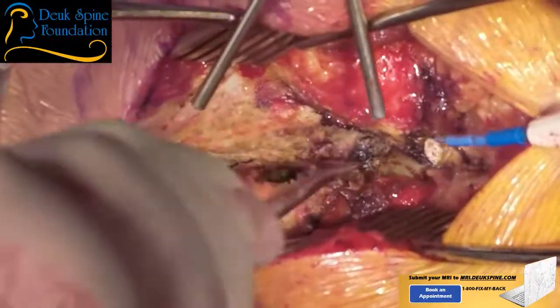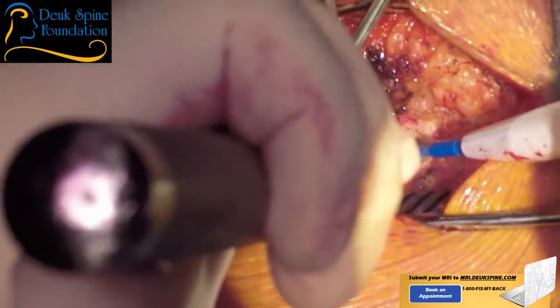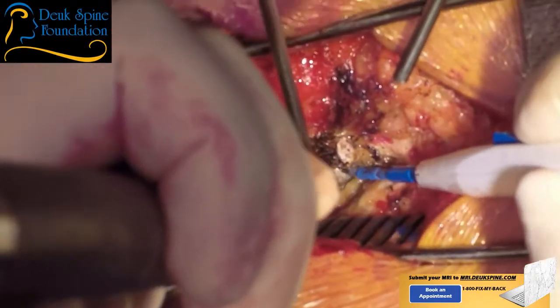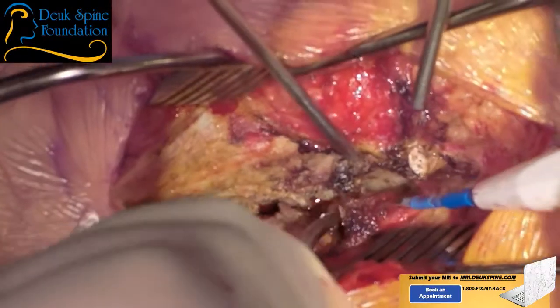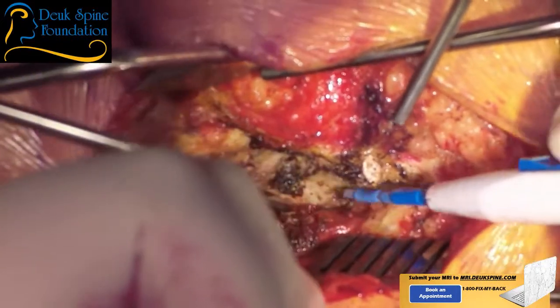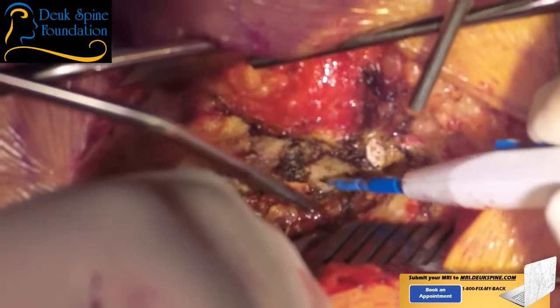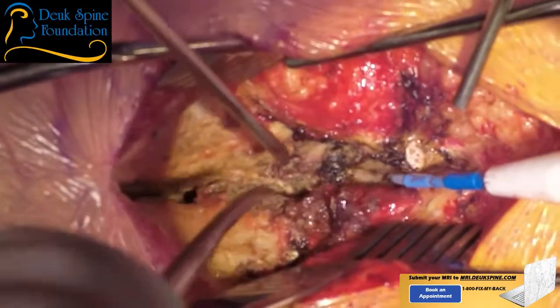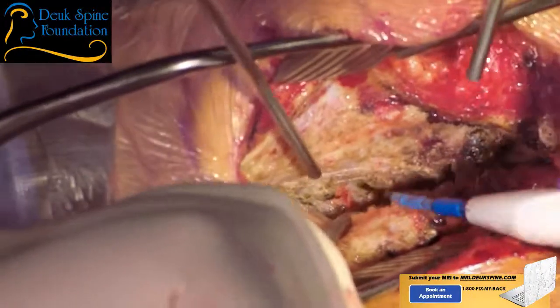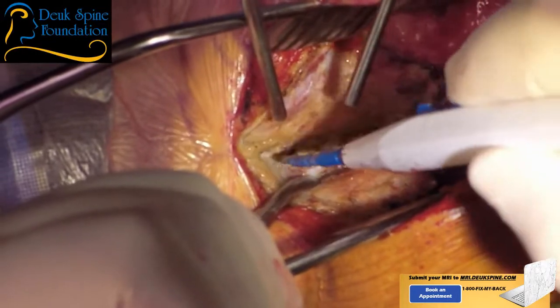So I'm dissecting the muscles off of my side of the spine, which would be the patient's left. Next, I'm going to head over to Dr. Patel's side, my partner and assistant surgeon, and blood pressure must have come up a little bit. See that? We got a little bit of spontaneous bleeding. When the blood pressure comes up and you have to start chasing the bleeding, you basically stop operating. You're no longer making progress. So it's real important that we keep the blood pressure under control.